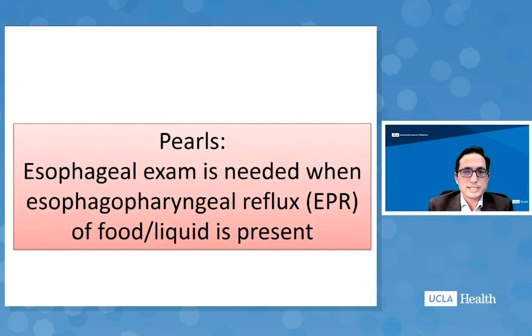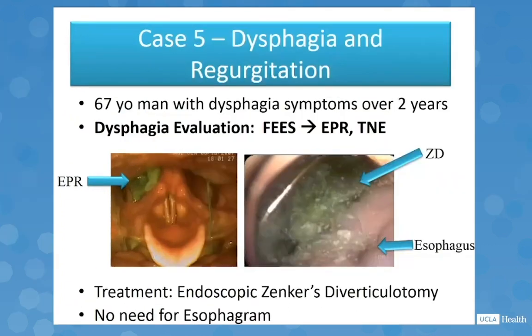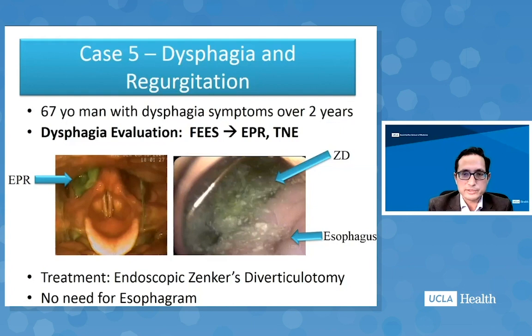Esophageal exam is needed when esophagopharyngeal reflux of food or liquid is present. A 67-year-old man with two years of dysphagia symptoms had a swallow evaluation showing green material in the right pyriform sinus that had been swallowed and then regurgitated back into the throat. The patient gave a history of food immediately coming back up after eating. TNE showed a Zenker's diverticulum — the esophageal opening anteriorly and the diverticulum posteriorly containing the food and liquid just tested. With this confirmed diagnosis, no esophagram was needed and we could proceed to endoscopic myotomy.